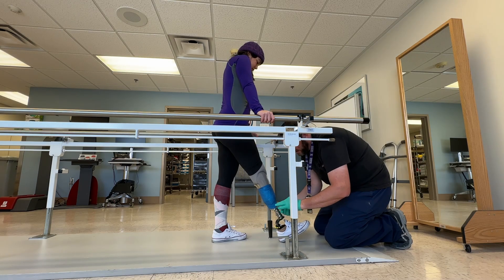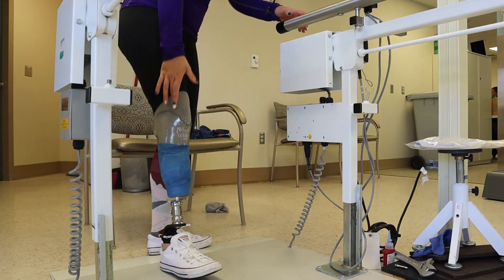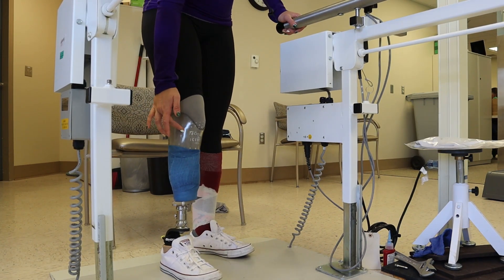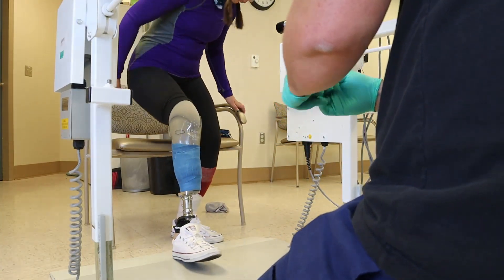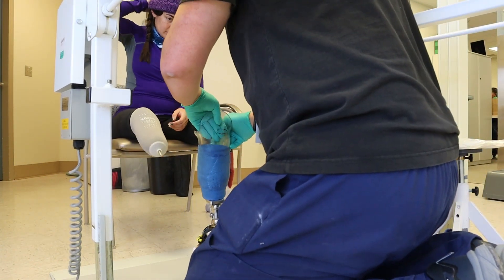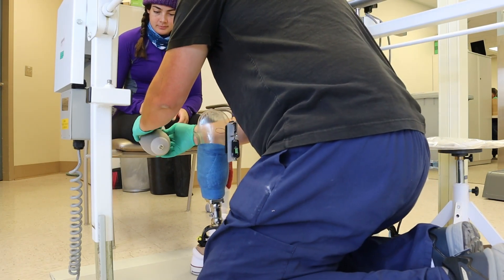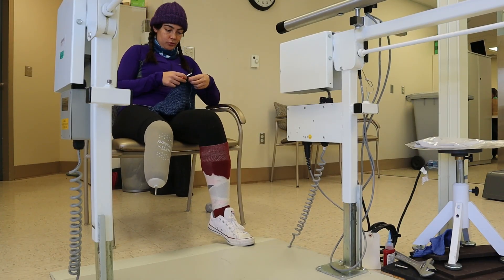It's driving me nuts. It's also my fibular head is grinding a little bit. Is it hitting the front, the back, or just everywhere? It's right here. The condyles are feeling okay? It's just this back part. There's a little flat spot right there. A little bit lower — down here? Yeah. All right, be back in a couple minutes.